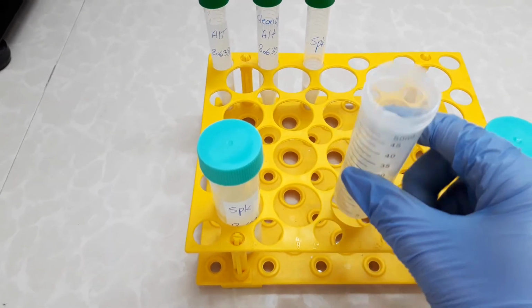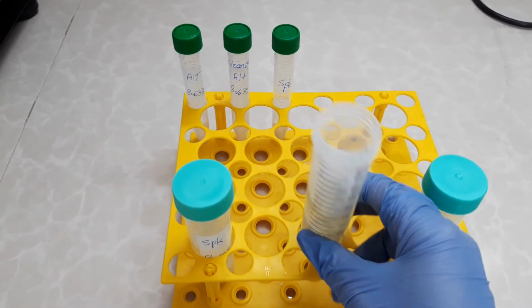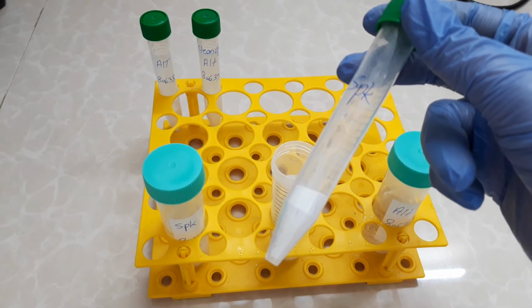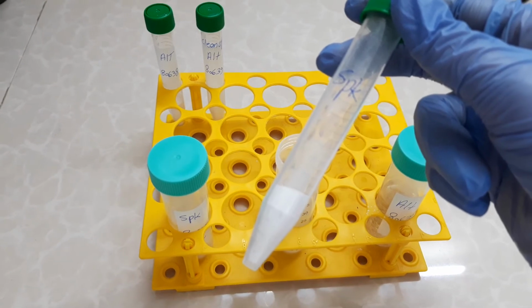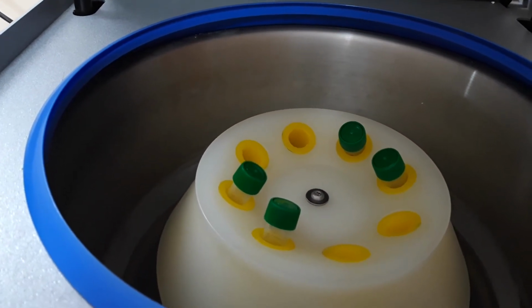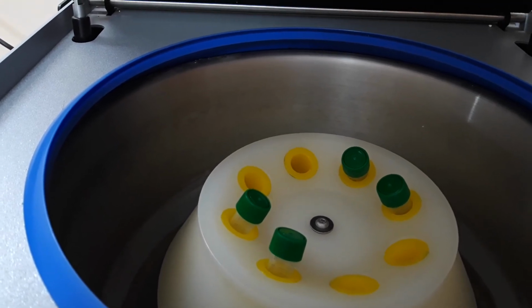Okay, after centrifuging the sample, we have this sample with a lot of solvent. 8 milliliters of the solvent will be removed and added to the cleanup kit, which includes primary secondary amine, C18 and magnesium sulfate anhydrous. After that we shake it and vortex it for about 30 seconds. Then we put the sample again in the centrifuge for about 5 minutes at 5000 RPM and 5 degrees Celsius.